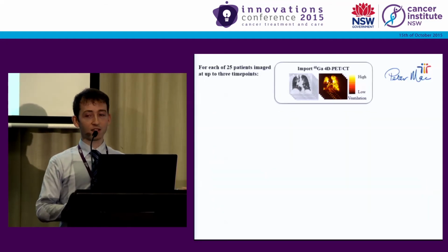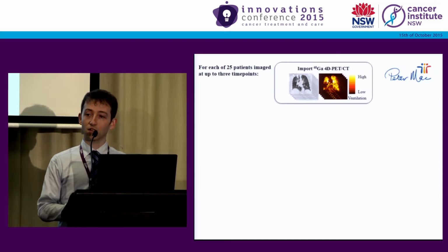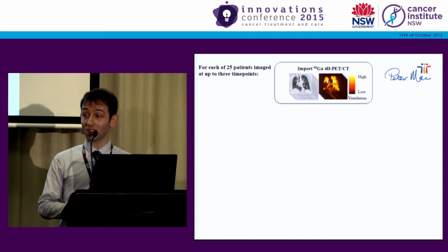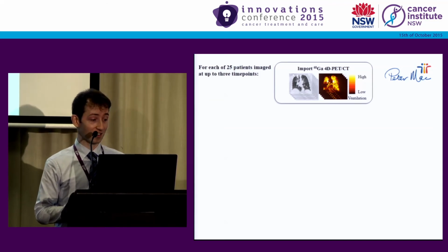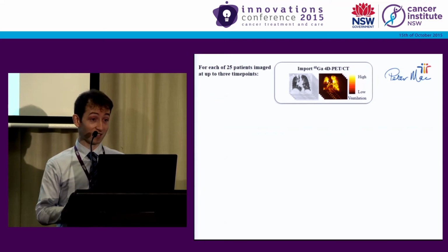So I guess one of the most satisfying parts of my work is that I get to interface with a few clinical groups in New South Wales and elsewhere in Australia, getting to look at 4D CT scans of patients and comparing them against other ventilation imaging modalities like SPECT and PET, often acquired on the same scanner. It's really exciting to be looking into a new technology like this and trying to determine how accurate it actually is. This is one example of how a cross-modality validation study works.